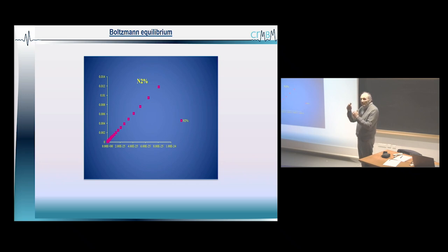It means that the difference between the two levels in terms of amount of nuclei is very small, and it explains why this technique, NMR, is very poorly sensitive. It's not a very sensitive technique. We are able to get very nice images just for one reason: we've got millions of nuclei, millions of molecules of water, for instance. So that's why you've got nice images.